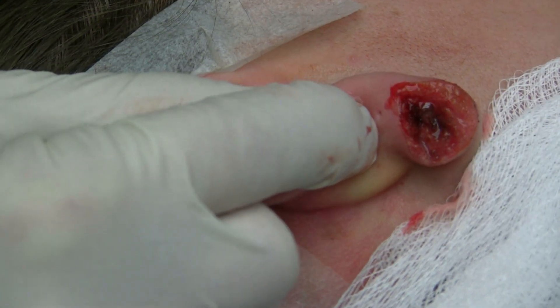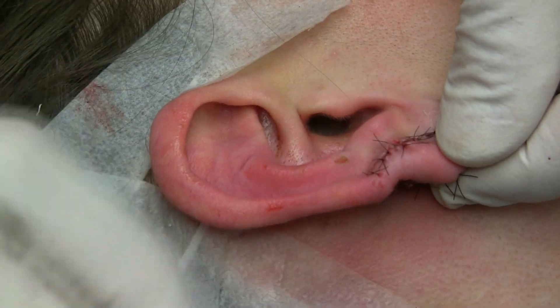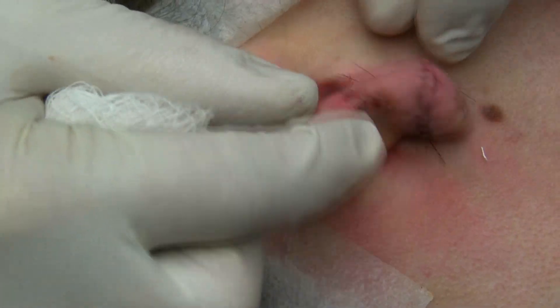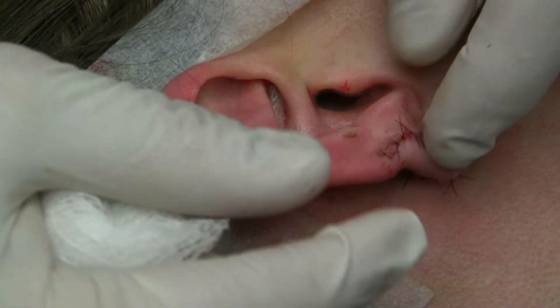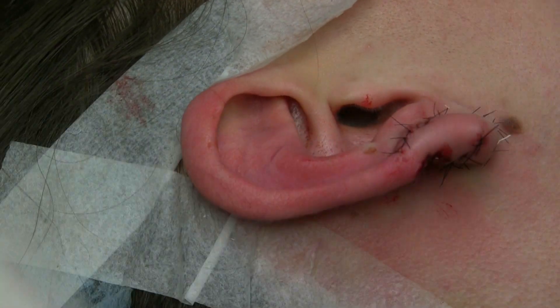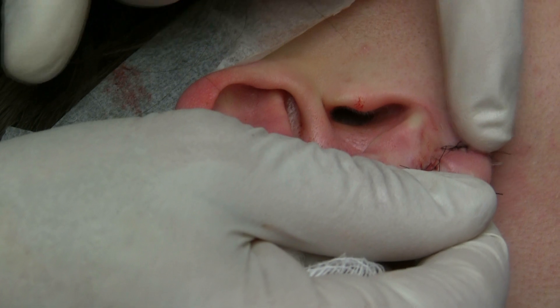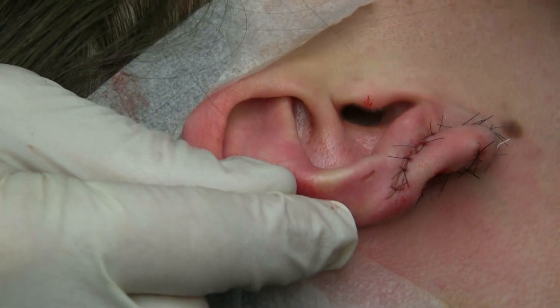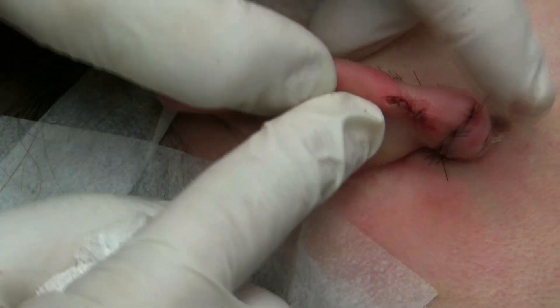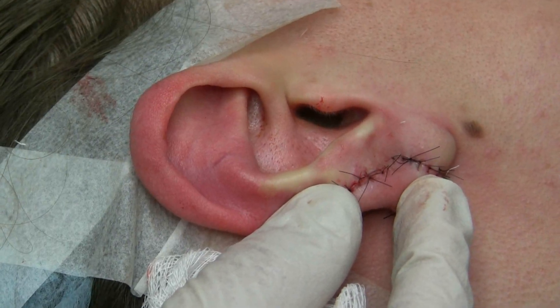And then we'll close it. This was a keloid from ear piercings that had gone wrong, and we've removed the front and back. It was a very, very large keloid and we tried to preserve as much earlobe as we can. Our biggest challenge is going to be that the ear is going to want to fold in. But after this heals, we can put some filler — probably some silicone in there or some fat — to give it a little bit more bulk and pop it out. Basically, that's our laser keloid removal. This is Dr. Joe and I am at lovethatface.com.